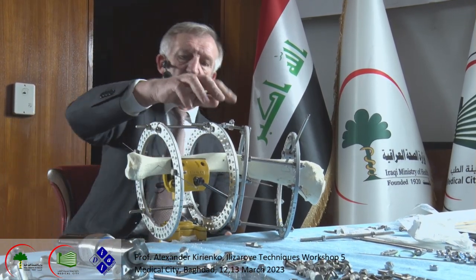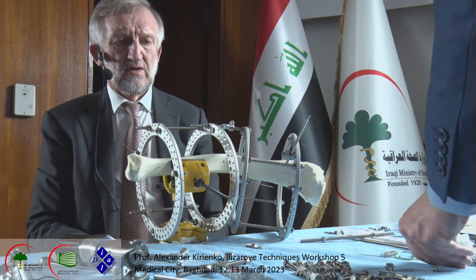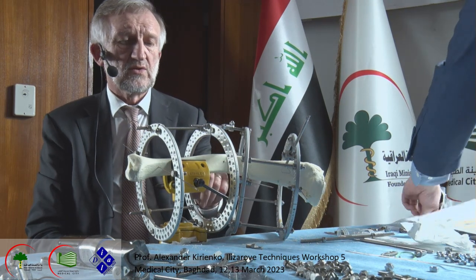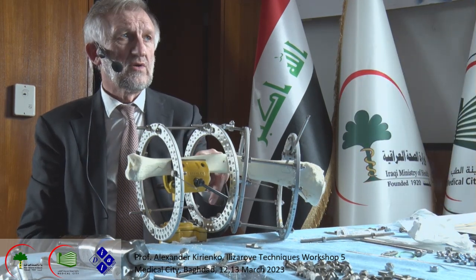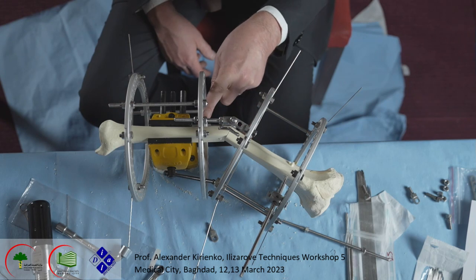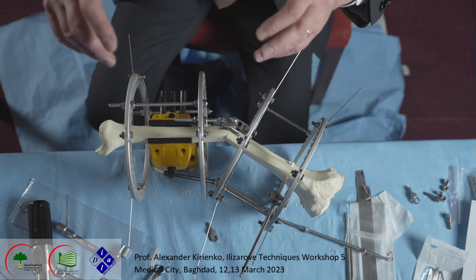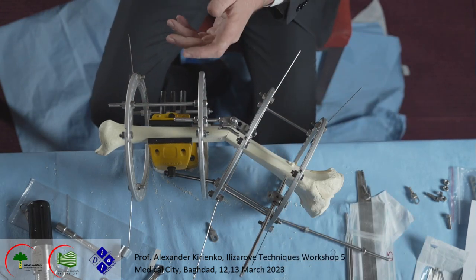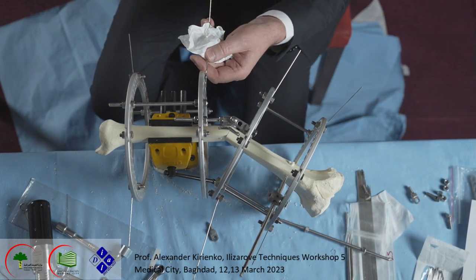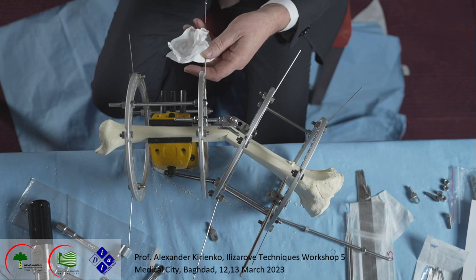For this reason, we don't need to buy biplanar hinges, but this hinge is only monoplanar, and we correct the varus deformity. Now, we put an olive wire here, because like I said before, we need pushing force from the lateral side. This is one olive here. Now we put another one here. Pay attention. Okay, we put this. Maybe displace it differently.